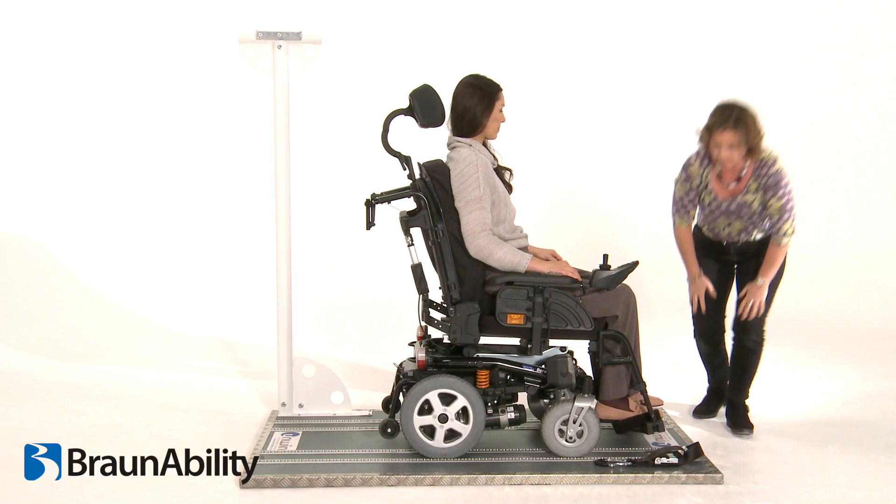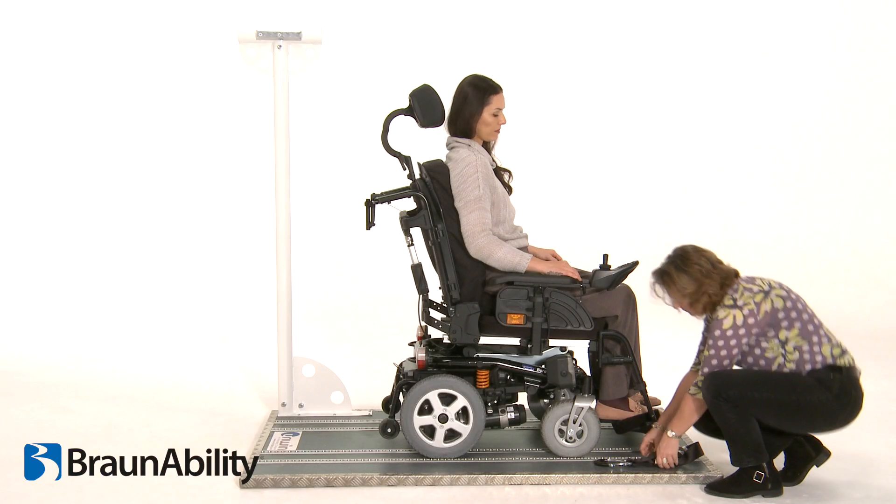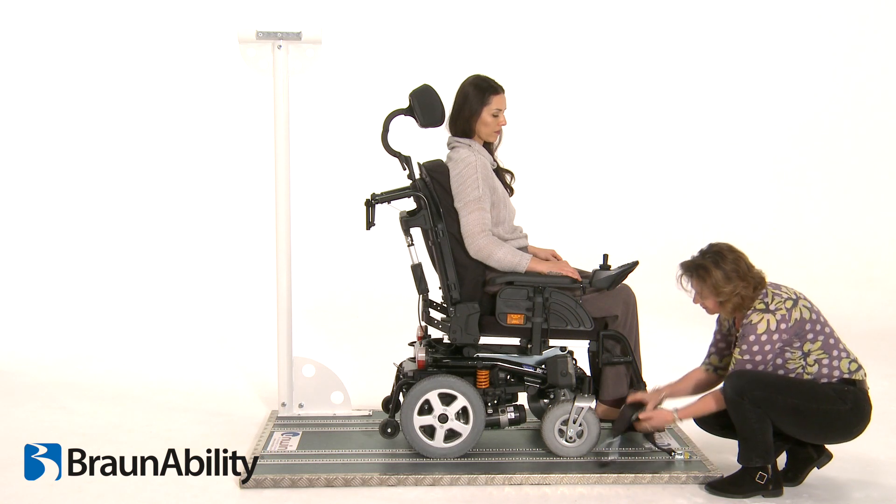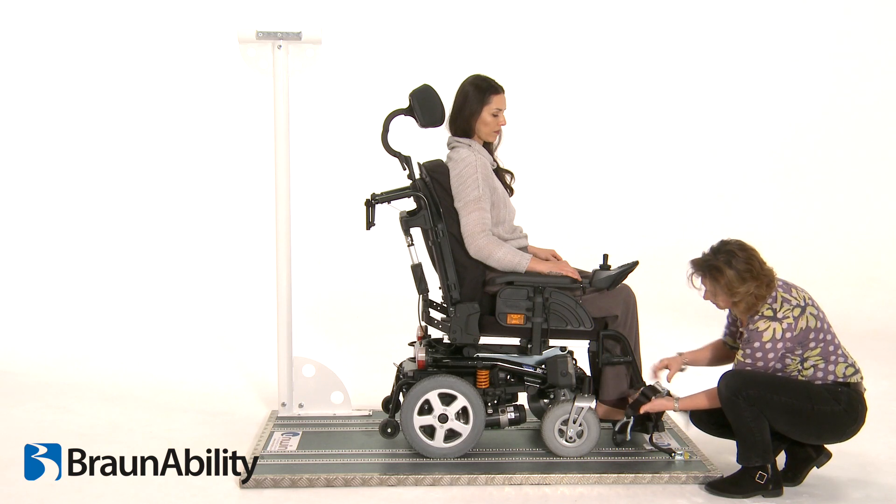Be careful not to over-tension the tie-down straps. Install the second tie-down, ensuring that the position of this is parallel with the first, and repeat the procedure.